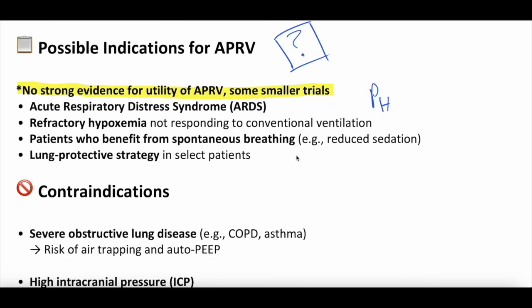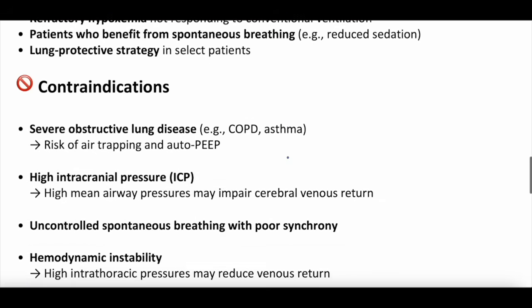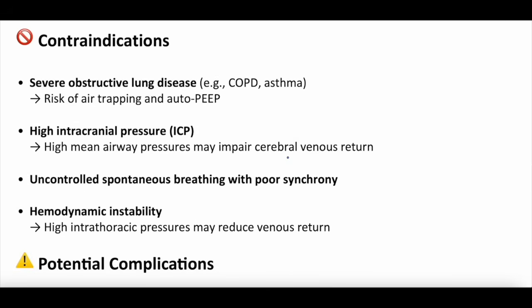And then there's an idea that this might be a more lung protective strategy in certain patients, so that's a consideration too. But again, no super strong evidence in any of these, at least at the time of this video recording. Contraindications are arguably more important because you can do harm with this mode of ventilation, okay? Patients with severe obstructive lung disease, they don't have the ability to adequately ventilate in APRV.